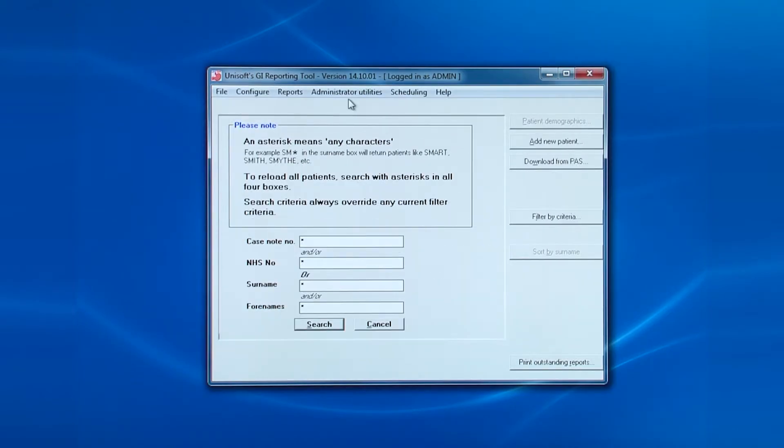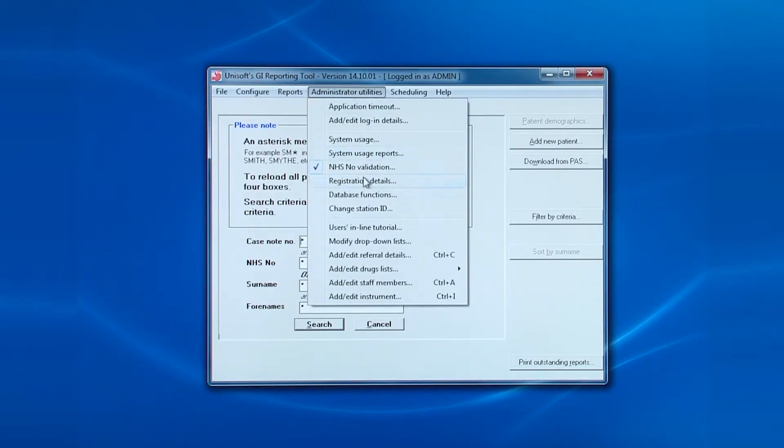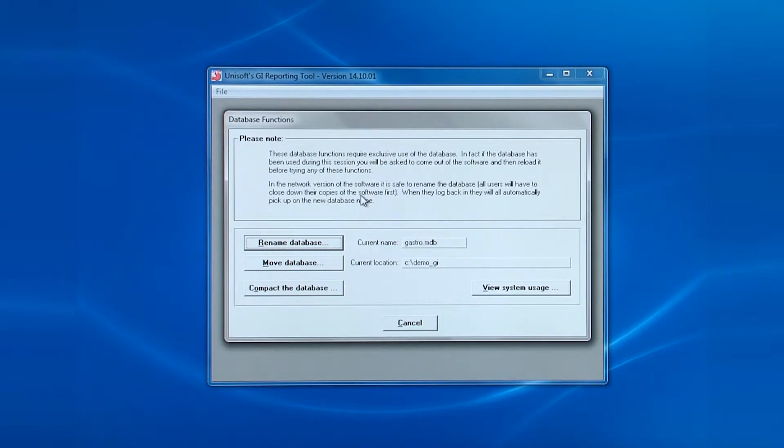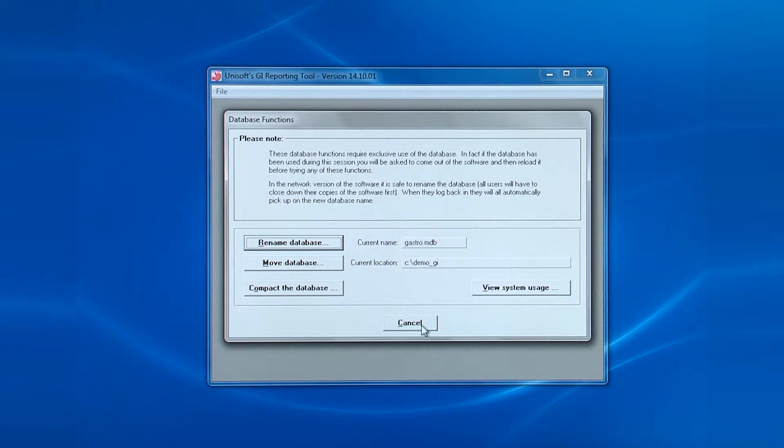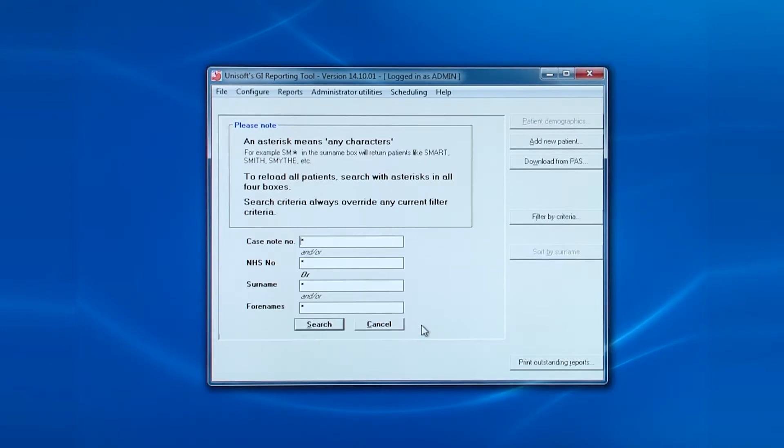The next entry are the database functions. Again, this is a legacy from older versions of the software and may not be enabled for your trust.